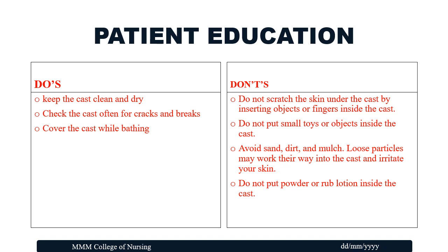What will be the do's and what will be the don'ts to be educated by a nurse. Keep the cast clean and dry. Check the cast often for cracks and breaks. Cover the cast while bathing. All these are the instructions you have to give.